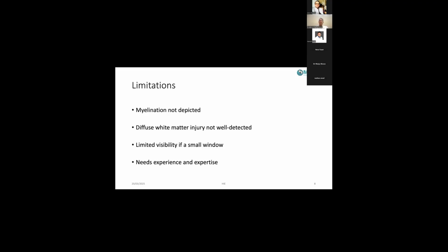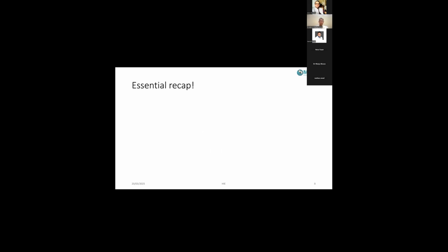It can happen in late preterms as well, but most commonly in term babies, where you already have a smaller fontanelle. So it becomes a bit of a challenge there. And you need the experience and expertise to interpret the results and to manipulate the probe and the baby to get the right images to make those interpretations, monitoring, and relevant prognostications.